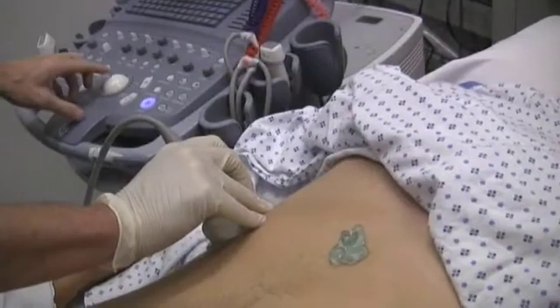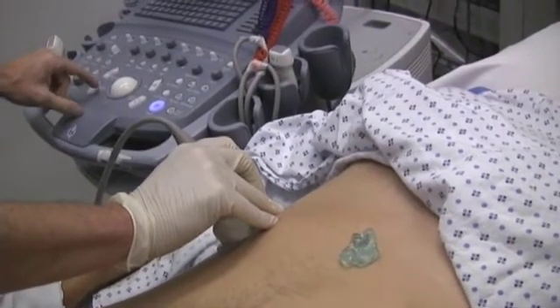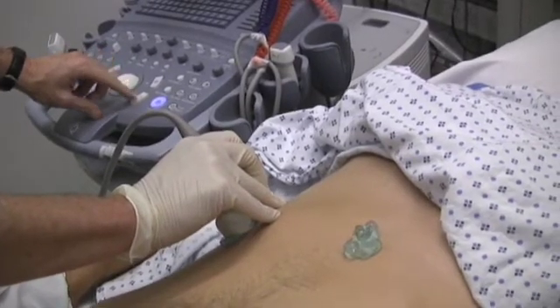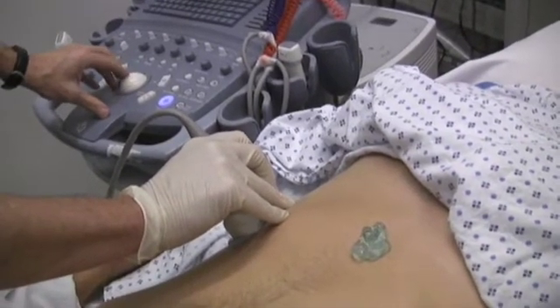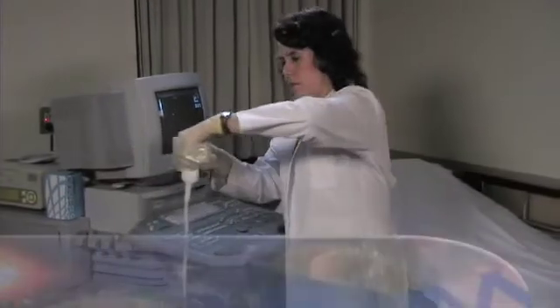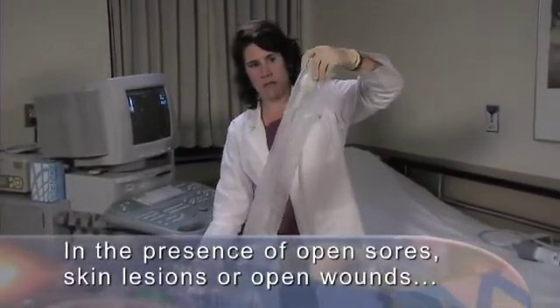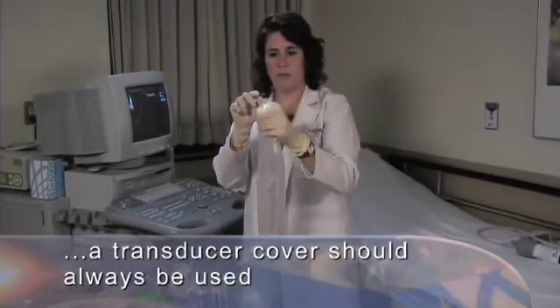For non-invasive studies on unbroken skin, transducer covers are not typically used unless there is the potential for contamination with blood or body fluids. However, in the presence of open sores, skin lesions, or open wounds, a transducer cover should always be used.